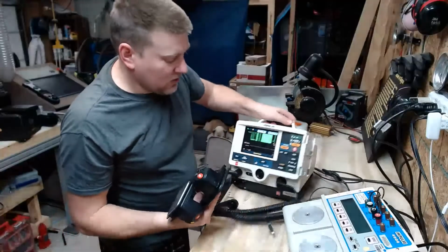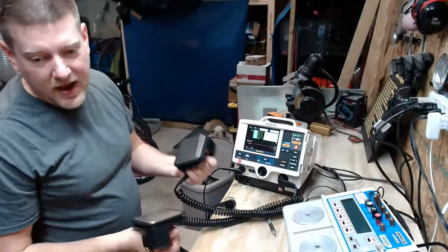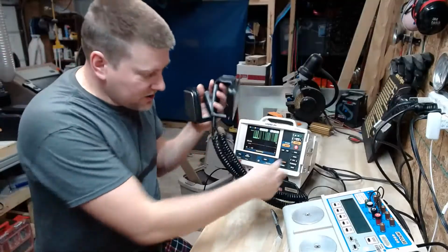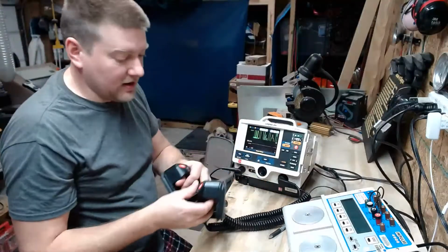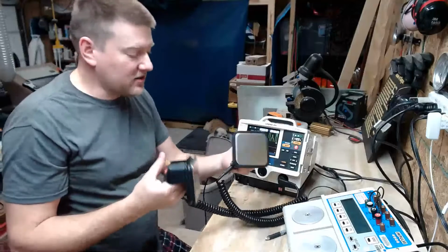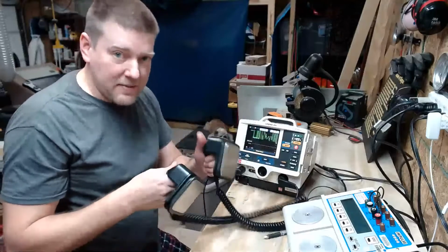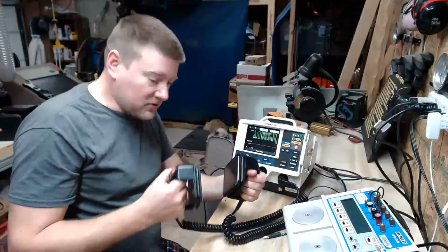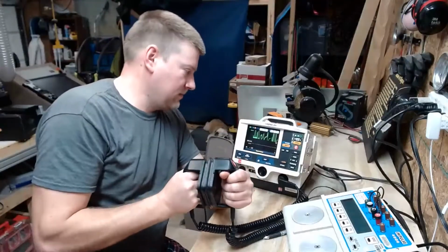But the first thing that we're going to test is the paddles themselves to make sure that the wiring and all the circuitry here is good, because paddles get dropped, they get slammed around. A lot of stuff happens to paddles, and they do go bad. So the way that you test your paddles is you stick them together.